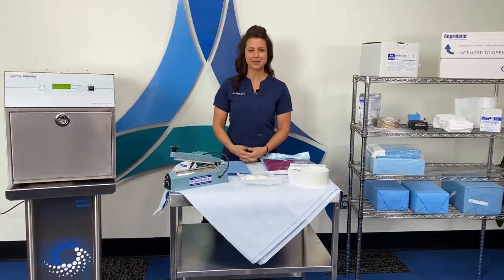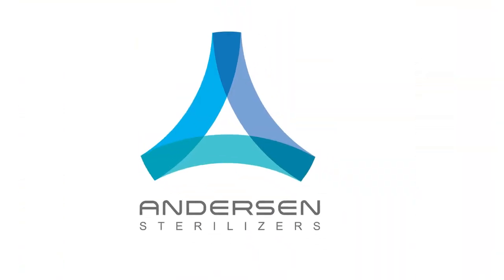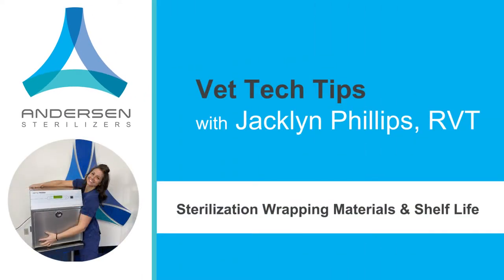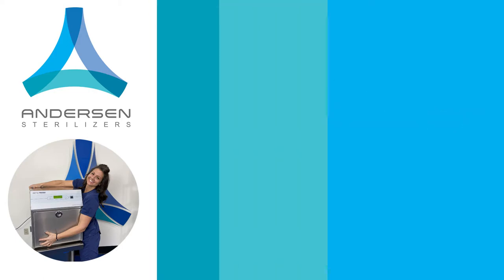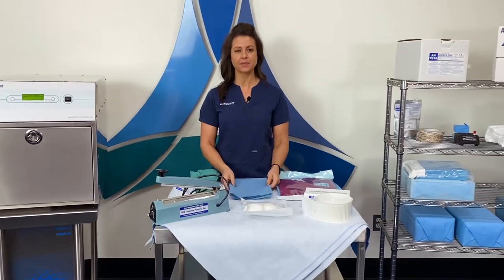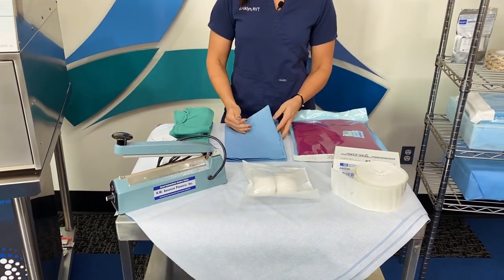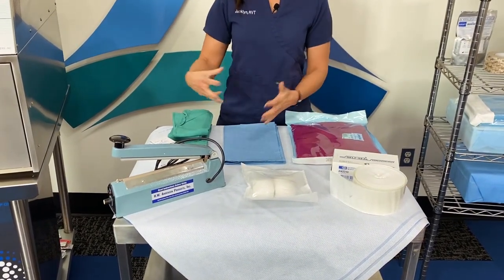Today's tech tip is about wrapping materials for your instruments as well as shelf life. Most commonly would be something like CSR wrap. This comes on the big blue rolls that you have in the hospital, generally for your surgery packs.